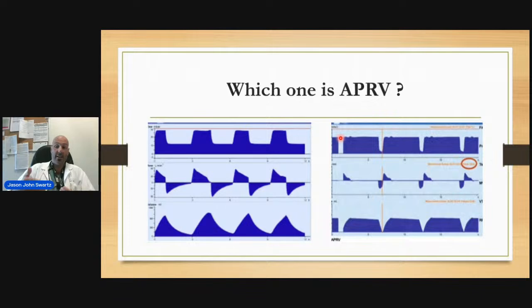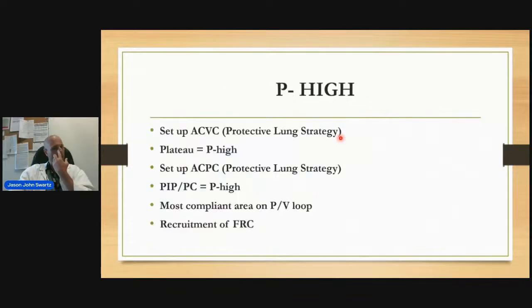It's been there for 3, 4, 5 seconds perhaps, diffusing CO2 into the alveoli. So when you do get the releases, that's how CO2 is eliminated and you get more bang for your buck. That all depends on the diffusion capacity of the lung, depending on what state the lung is in.